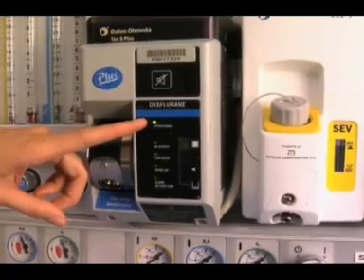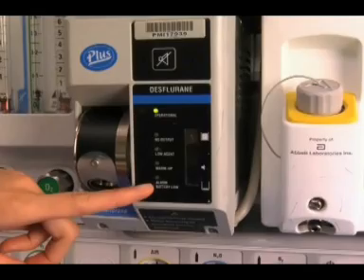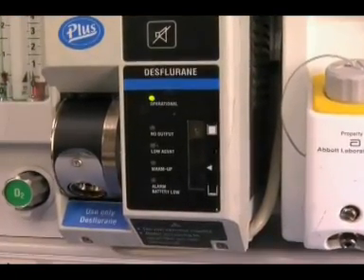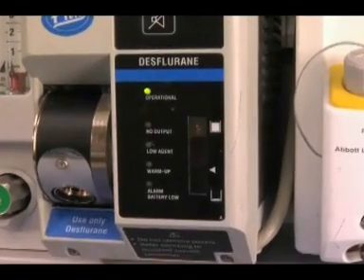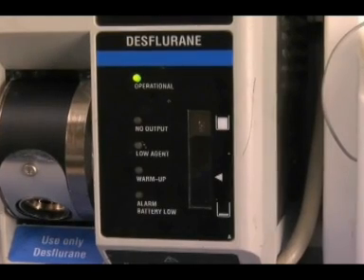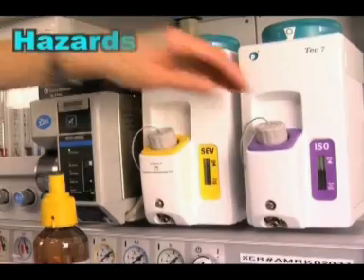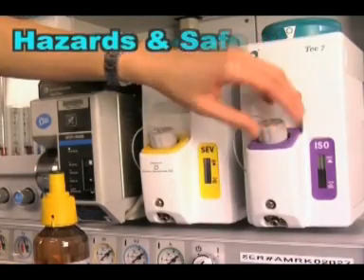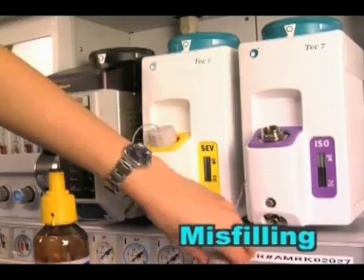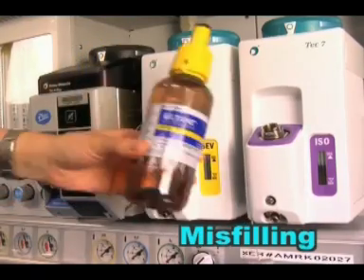Unlike other Tec vaporizers, desflurane models electronically control the temperature and pressure inside the vaporizer. Furthermore, the wick system is not utilized because desflurane saturates carrier gas quickly. One very unique feature of the desflurane vaporizer is the visual and audible alarm that signals the user when the vaporizing condition is not optimal or when agent in the vaporizer is almost empty.